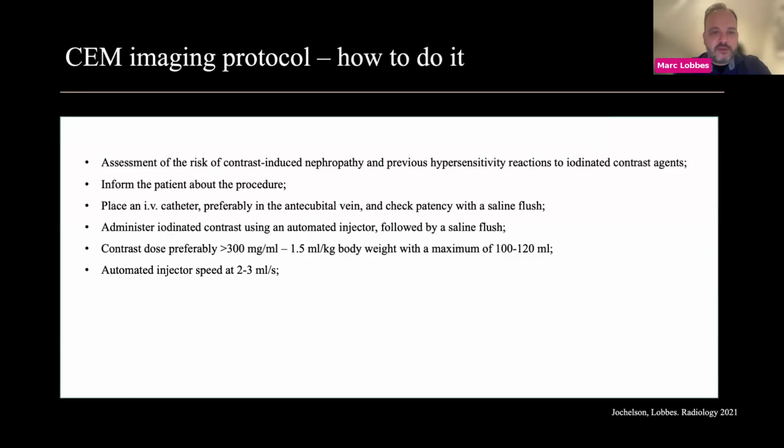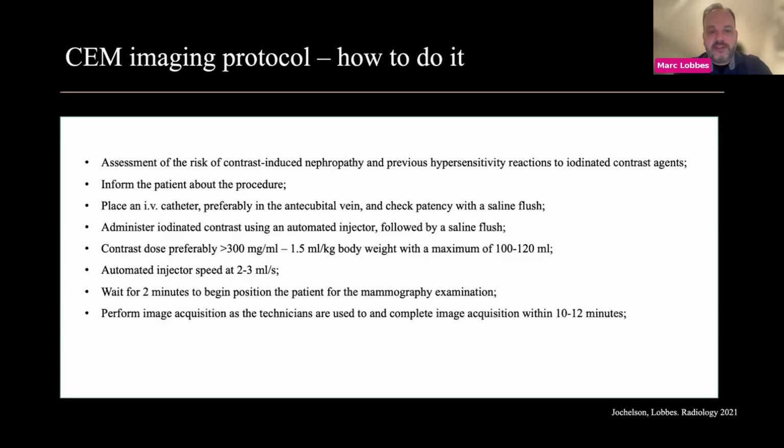The automated injector speed is 2 to 3 milliliters per second. It's just standardization of your protocol. But the most important thing is that you need to wait 2 minutes before you start any acquisition of the mammographic images. The contrast needs to circulate throughout the body, and you should start not sooner than 2 minutes and not later than 3 minutes with the first imaging acquisition. And please do the examinations in the order that you're used to.